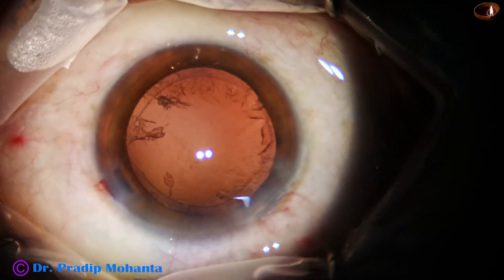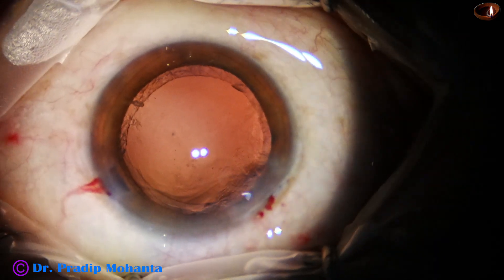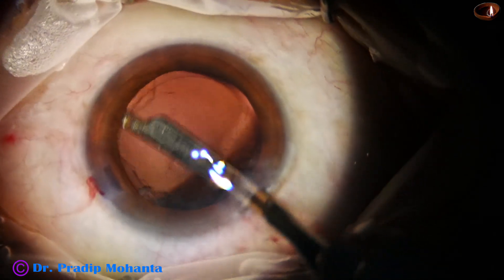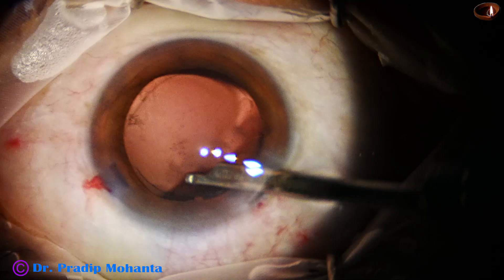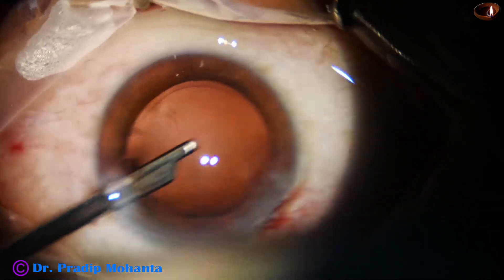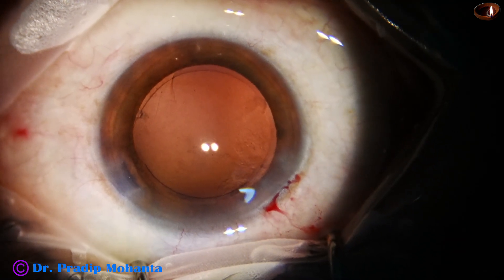Now the posterior capsule has been irrigated with the irrigation probe using bimanual IA. Then the cortical matter is being removed by a 23-gauge Simcoe cannula. We have only one side port, slightly larger, through which the Simcoe can go — and it is 90 degrees away from the main wound, so whatever astigmatism was produced by the main wound has been neutralized to some extent.